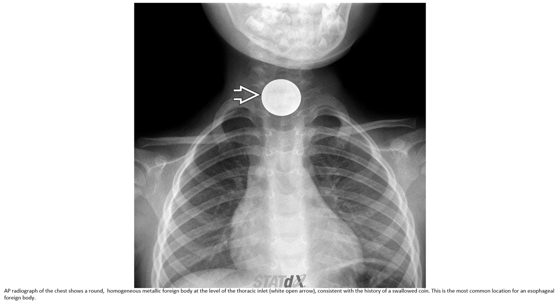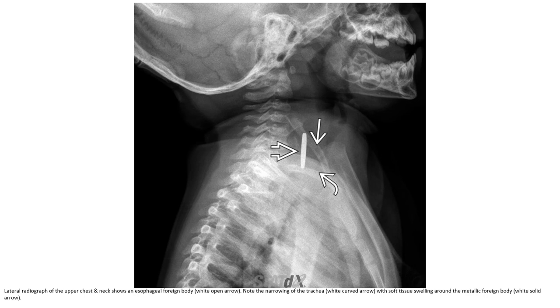This is an AP radiograph of the chest showing a round homogeneous metallic foreign body at the level of the thoracic inlet, consistent with the history of swallowing a coin. This is the most common location for an esophageal foreign body. The lateral radiograph of the upper chest and neck also shows the esophageal foreign body. Note the narrowing of the trachea with soft tissue swelling around the metallic foreign body.